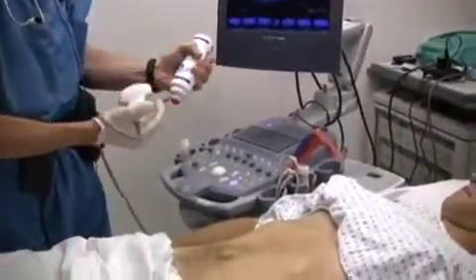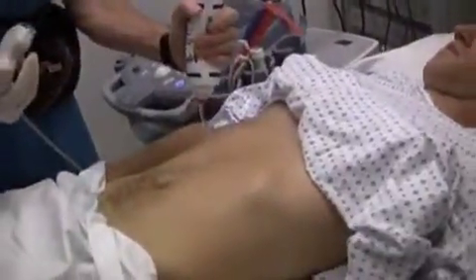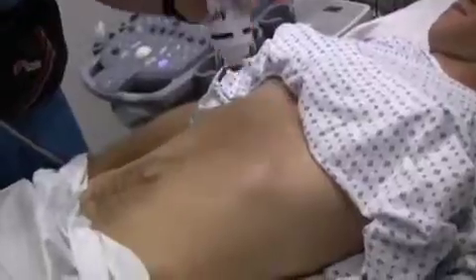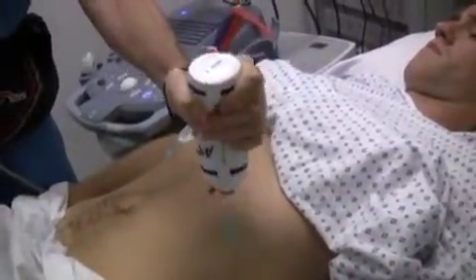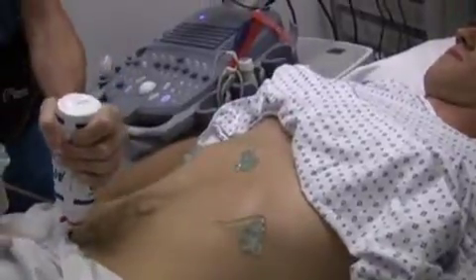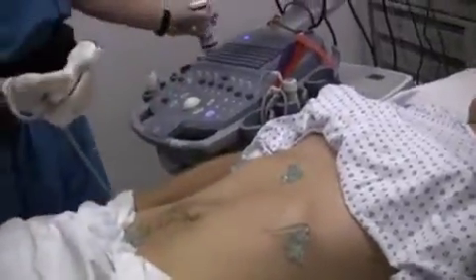It's good to apply gel liberally when you do this. You don't want to be reaching for gel or getting poor contact. I usually apply the gel in all four of the main regions at the beginning of the exam when the patient first arrives, then I don't need to worry about it again.